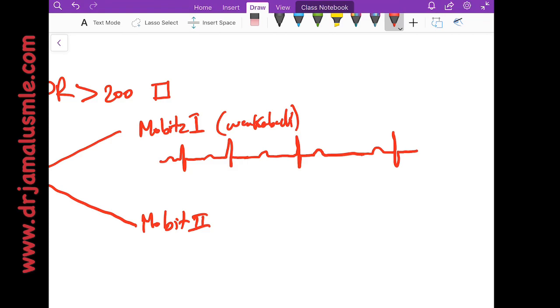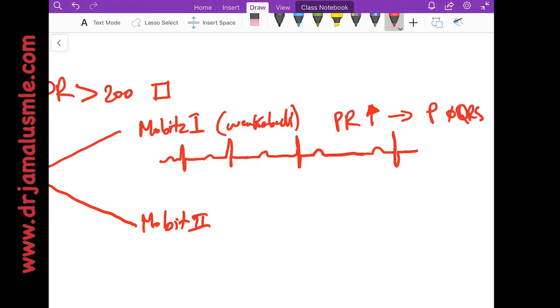So the PR interval progressively increases and then all of a sudden there's a P wave but no QRS. This is what we call a dropped QRS.